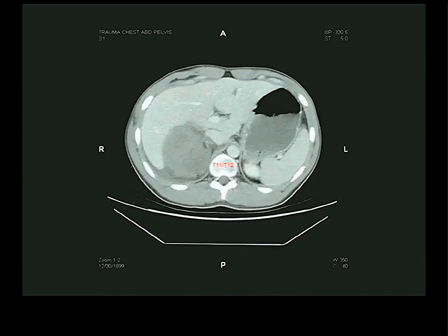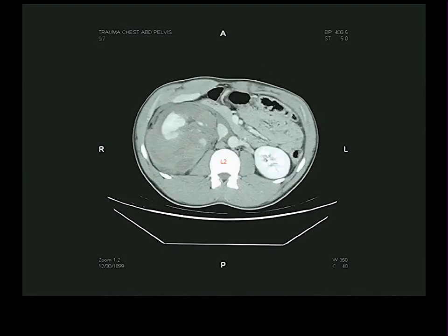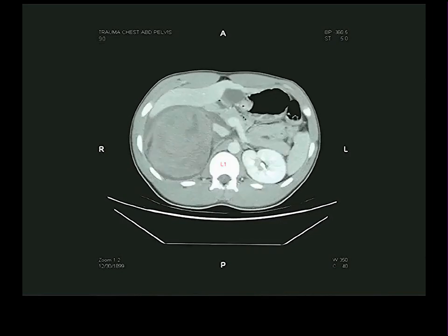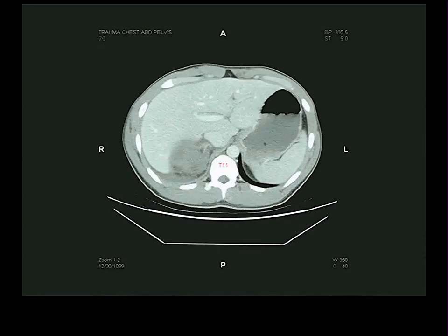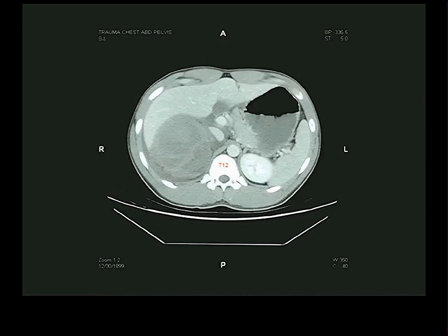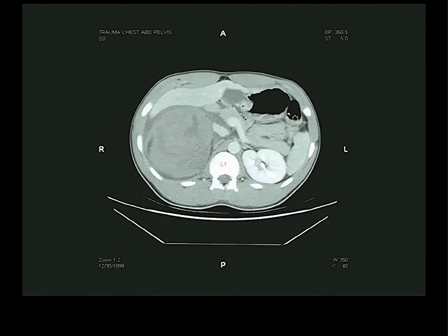The right kidney. This person had serious damage to the right kidney with bleeding into the capsule called Gerota's fascia, which is what's called perirenal and extrarenal. This is all blood clot. This whole big mass of stuff that we see here, starting right there, that big gray mass is all blood. It may not be clotted at this point. It's all blood because this person had trauma to the right kidney.